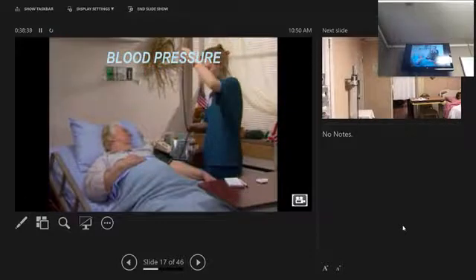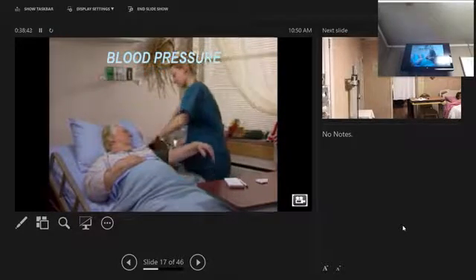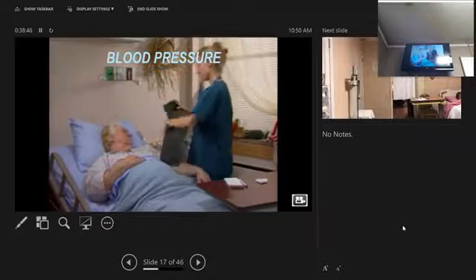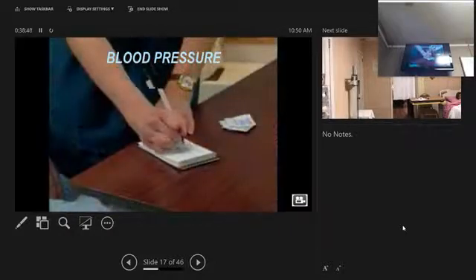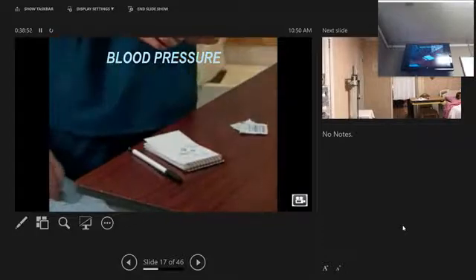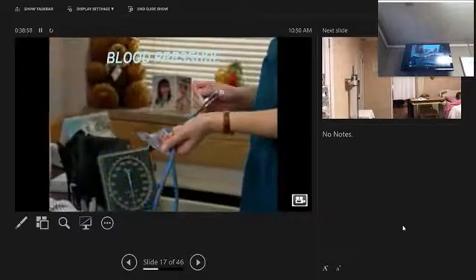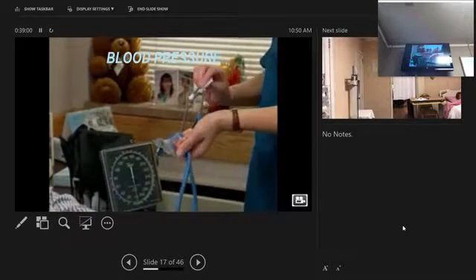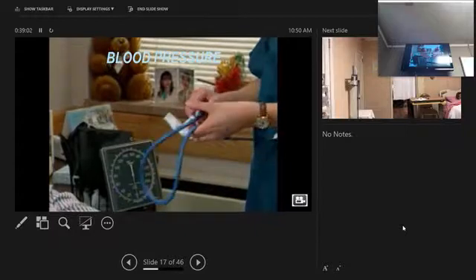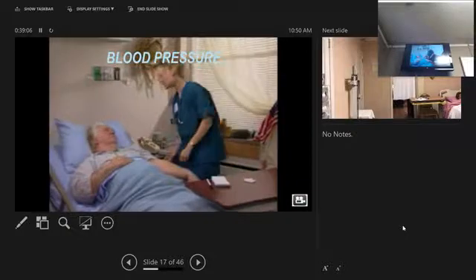Remove the stethoscope from your ears and the cuff from the resident's arm. Record your findings on your notepad. If you are unsure about the blood pressure, wait for 1 to 2 minutes and check again. Clean your stethoscope after each use by wiping the earpieces and diaphragm with an alcohol sponge. Perform your procedure completion actions. Report any significant changes to the nurse.